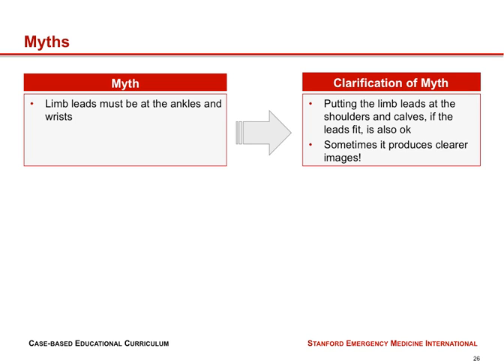Why is this important? This is important especially in patients who have had amputations from trauma such as motor vehicle accidents or landmines. Do not think you can't do an ECG in patients who have had amputations. You can. What is important, though, is that within each region, the lower extremities, for example, if you move up to the calf because a patient does not have an ankle on the left leg, then you need to do the same thing on the right leg. If you move up to the area close to the shoulder on the left arm, then you need to make sure to do the same thing on the right arm. And some ECG technicians say that the clearest images are actually produced when those limb leads are closer to the torso. So, practice with a variety of different positions.